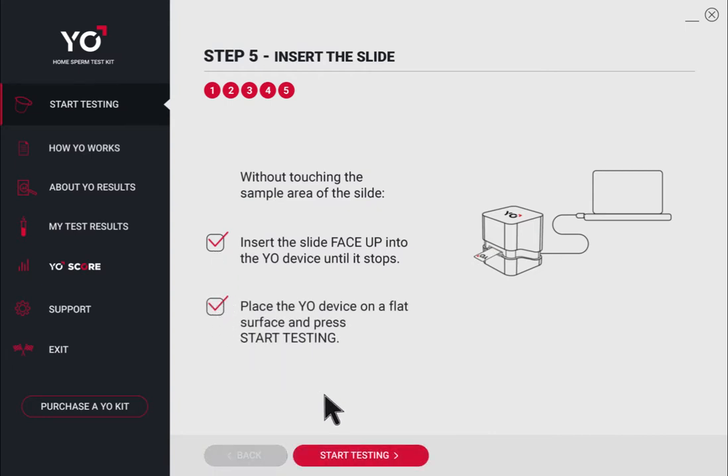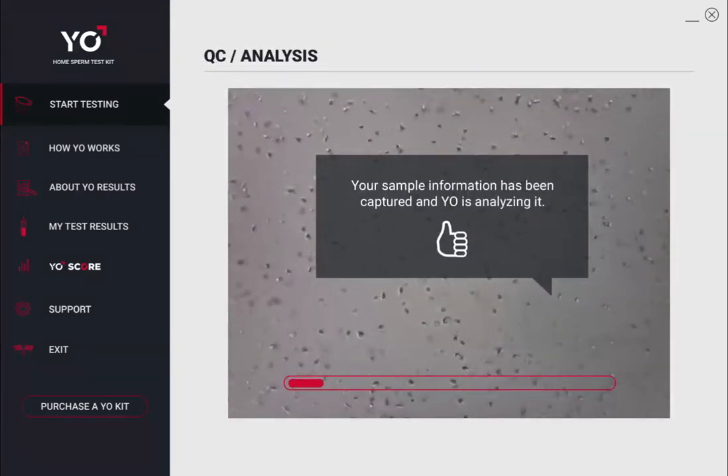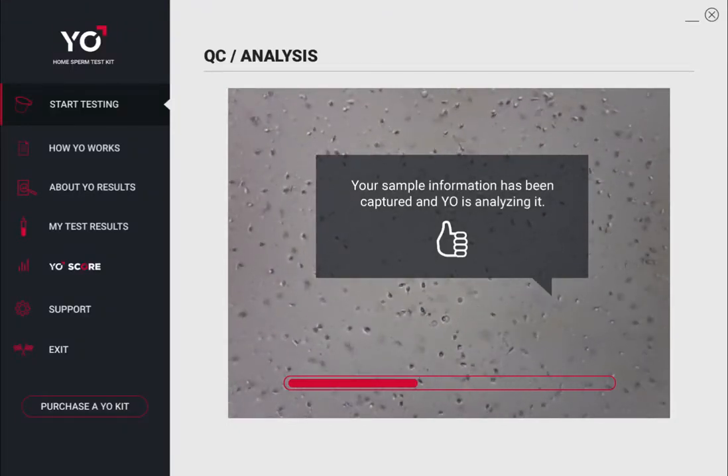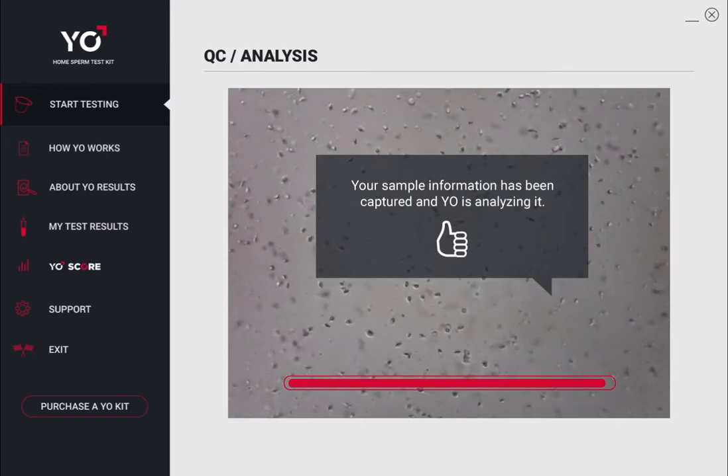Insert the prepared slide face up into Yo, all the way. Click Start Testing. Don't touch — Yo is recording a video of your sperm. Yo will now analyze your sperm video, and your test results and video are shown in less than two minutes.